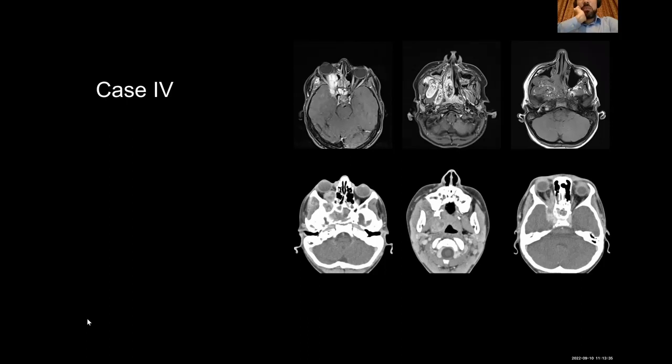Other differential? No, don't worry. I think it is very clear that the bone and the appearance are young age. Adolescent. What can you clarify? Infection?